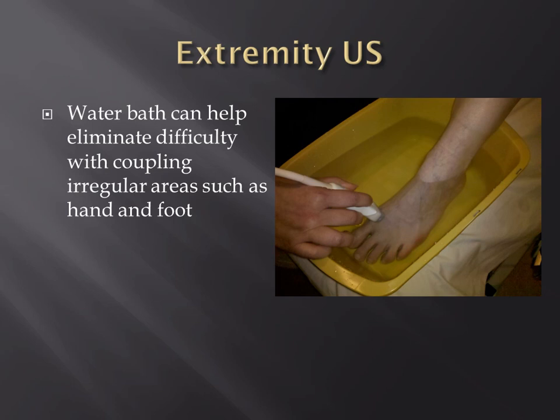Now, this is a throwback to original ultrasound imaging when it used to be done in a literal water bath to couple the transducer with the patient. And we've gotten away from that now that we have nice gels with less impedance than actually water and can give you pretty good images. But when you're dealing with a foot or a finger or a toe and you're just having a hard time getting the transducer to give you a good image, the water bath can be very helpful. The transducer is sealed.